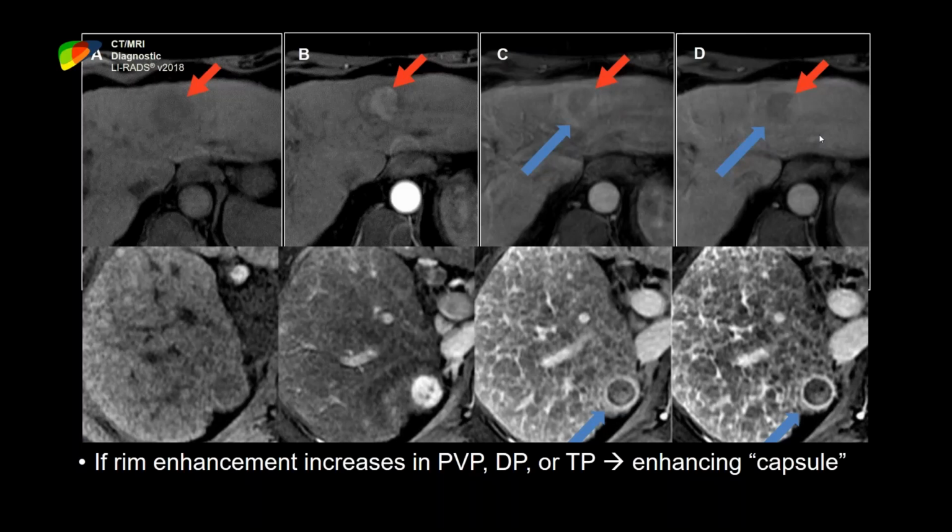No, we appreciate that feedback. Right now in LI-RADS, we have that information in what's known as an FAQ, a frequently asked question. In the LI-RADS core document and in the LI-RADS manual, we do explain that arterial phase hyperenhancement and washout do not need to spatially coincide and should be evaluated independently, but it's possible that we don't make that clear enough.